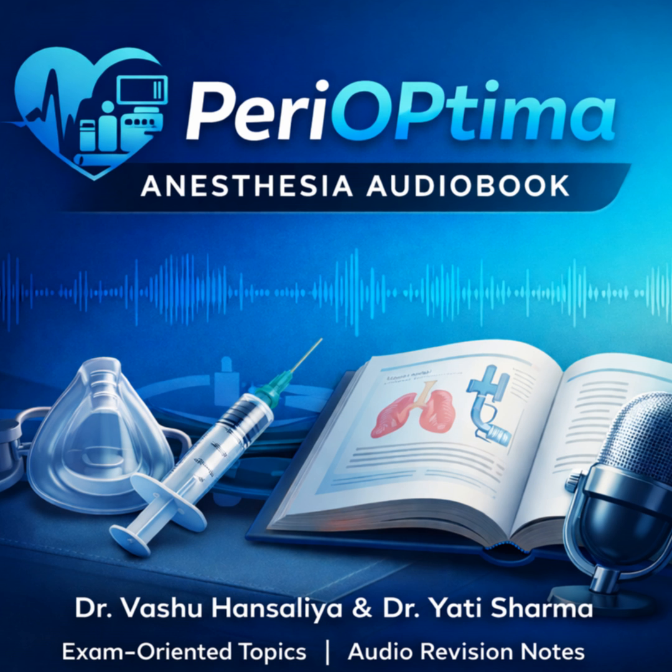The working principle is often overlooked because it seems so simple, but it's key to understanding its limitations. It is. It creates a low-pressure seal around the laryngeal inlet. So when the cuff is inflated, the mask settles, with the distal tip lodging against the upper esophageal sphincter, the sides filling the piriform fossa, and the upper part sealing against the base of the tongue and the palate. This gentle positioning is what enables positive pressure ventilation, or PPV.